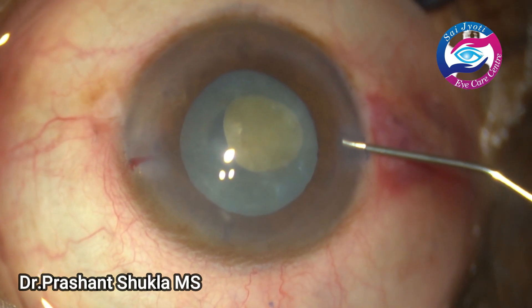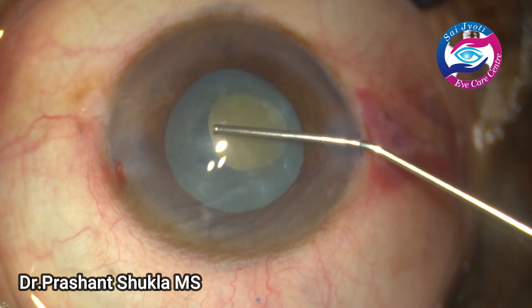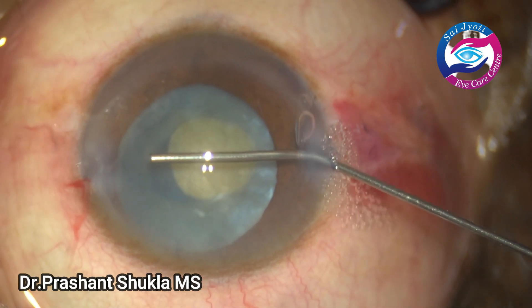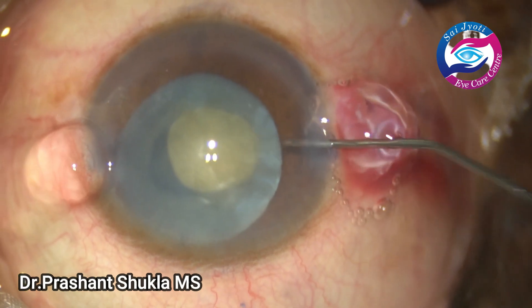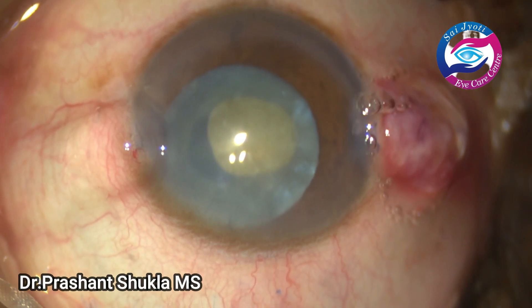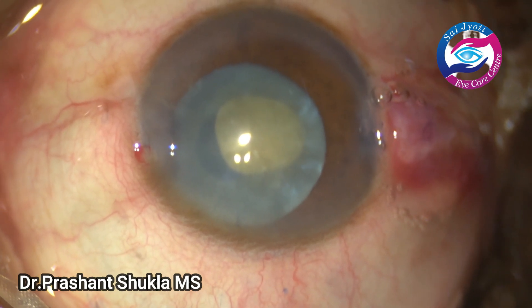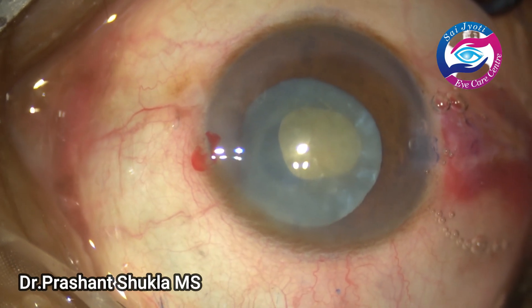Again sodium hyaluronate is taken and the entire chamber is filled up. I am also pushing viscoelastic into the capsular bag. This helps to keep the pupil slightly dilated due to the visco-mydriasis effect.